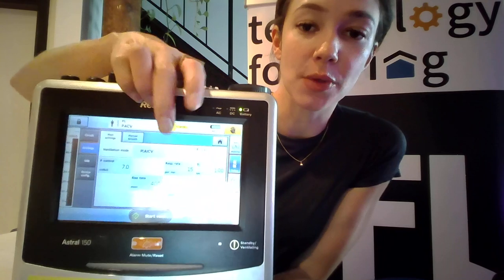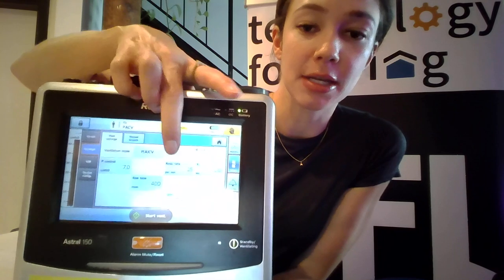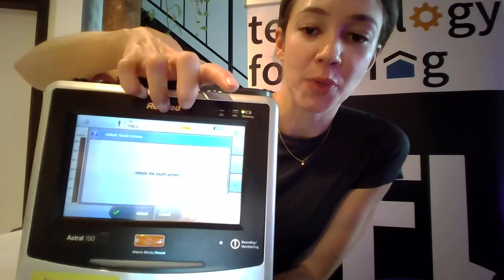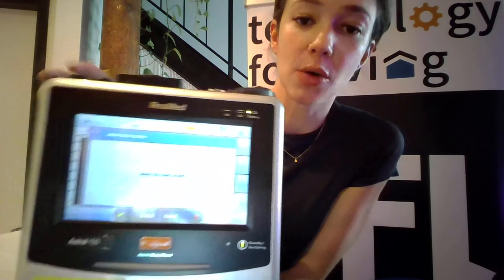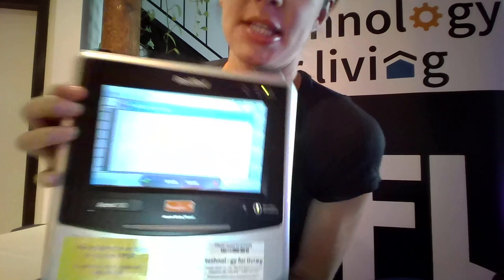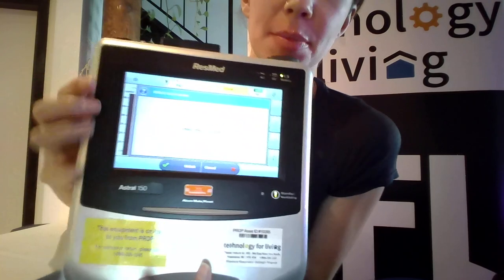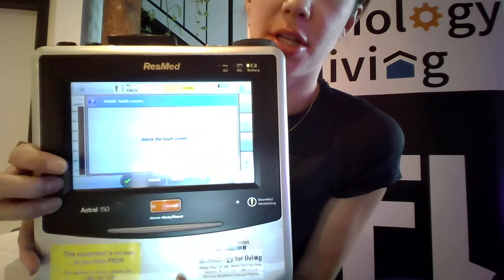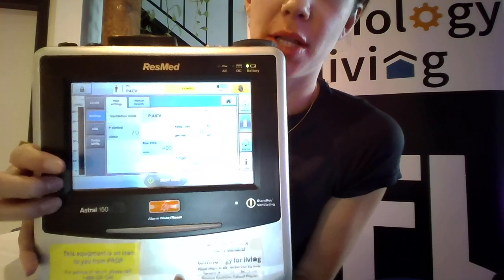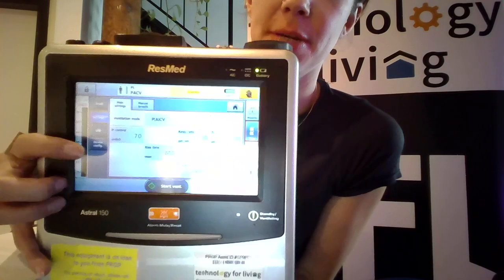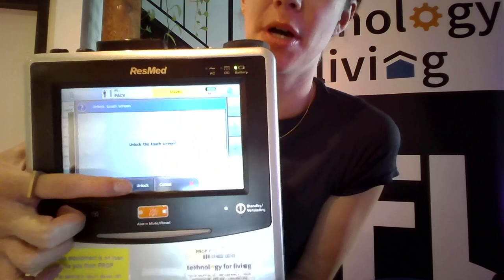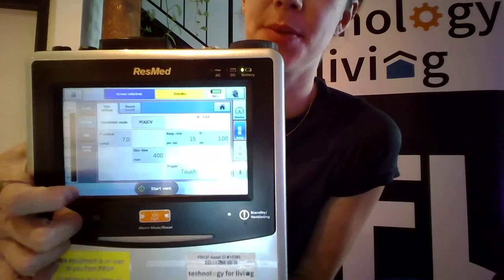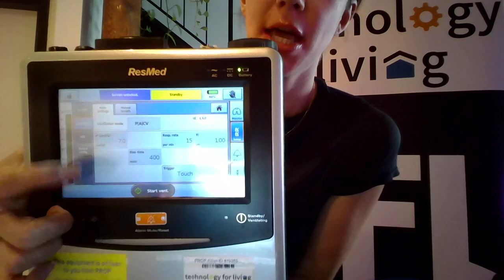The touchscreen will need to be unlocked first. We'll press anywhere on the screen and this menu will pop up asking us if we want to unlock the touchscreen, and we'll confirm at the bottom — yes, we want to unlock.